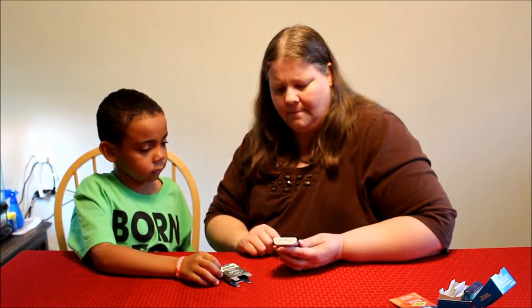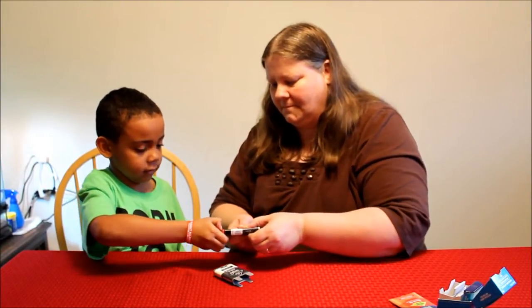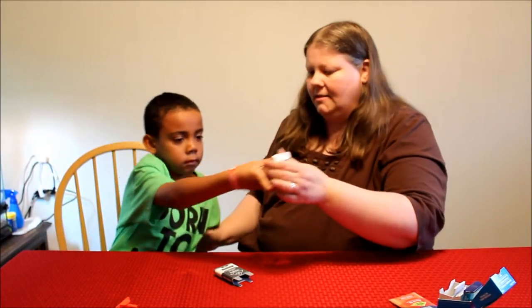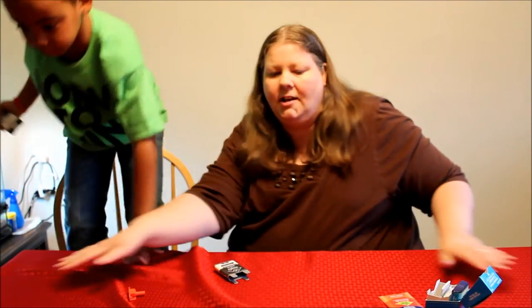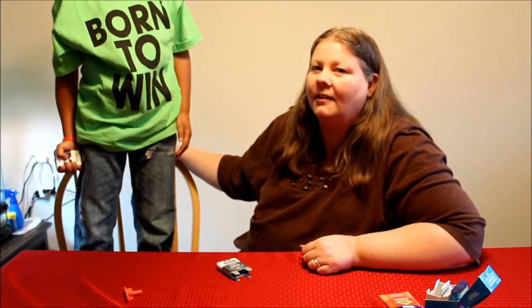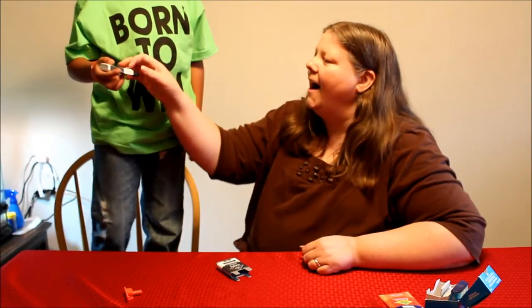The device instructs: 'If you are ready to use, pull off the red safety guard. To inject, place the black end against the outer thigh, then press firmly and hold in place.' Stand up, Jaden — five, four, three, two, one — injection complete, pull it away. Wow!